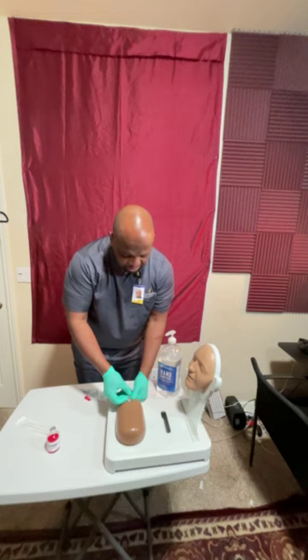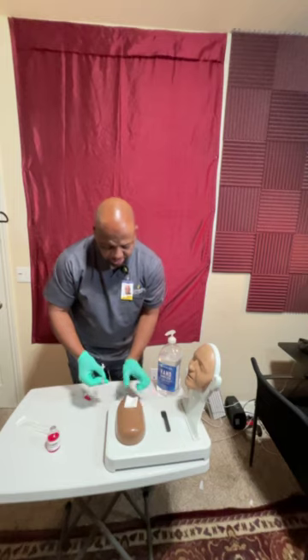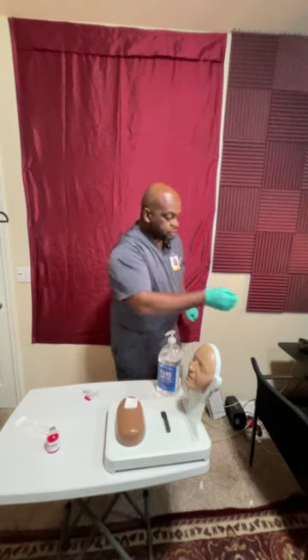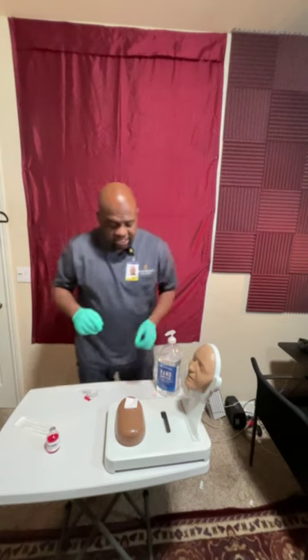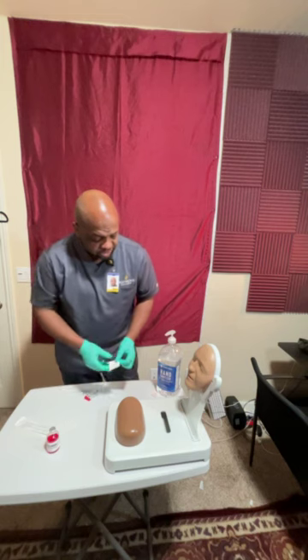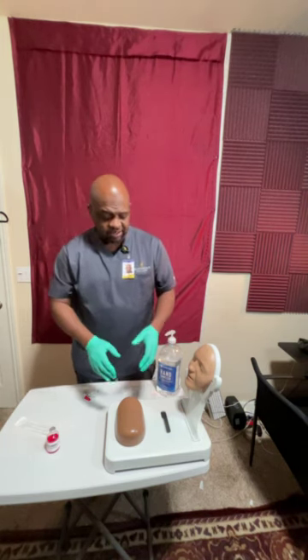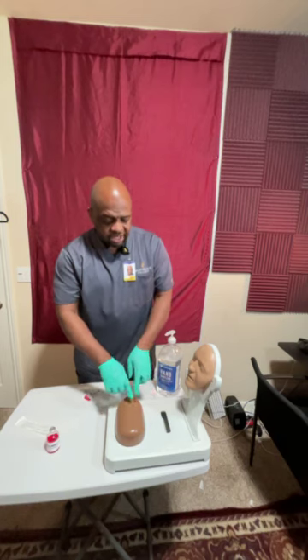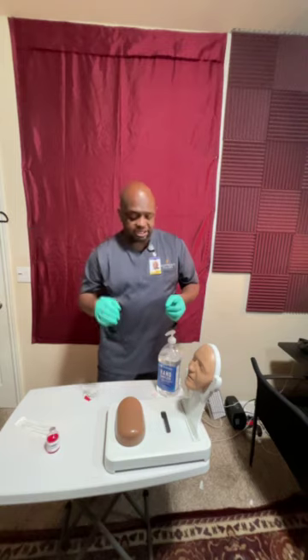The medication's in there. I'm going to remove the needle slowly, and once I remove that needle, I'm going to softly place the gauze right on top of that spot there. I'm not going to rub it or anything like that. Put the needle into the sharps container. And then from there, I'm going to just verify that there's no bleeding. There's no bleeding there, so I can remove that gauze. We don't want to use tape or a Band-Aid because sometimes the tape can cause irritation to the skin, cause the skin to be itchy.